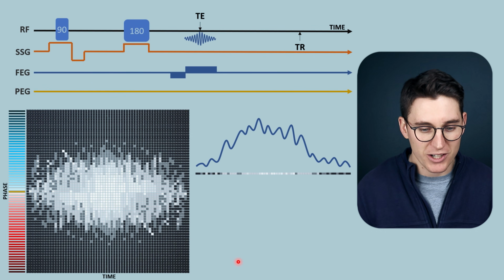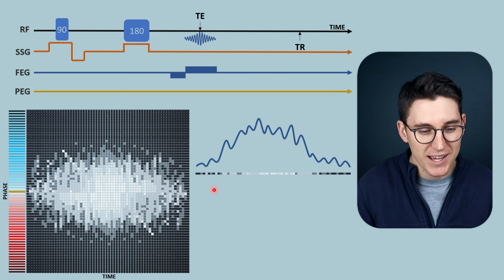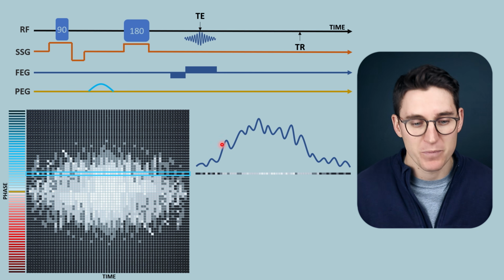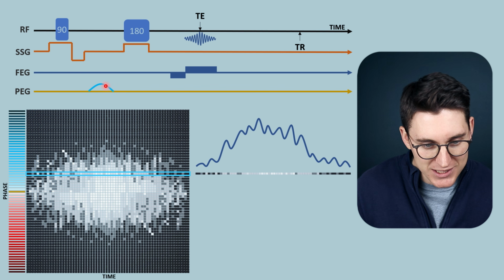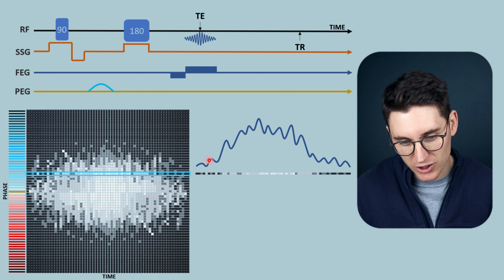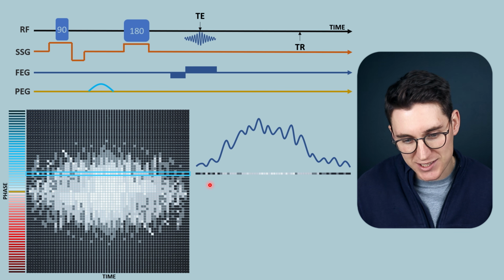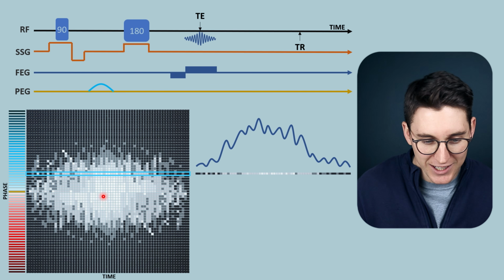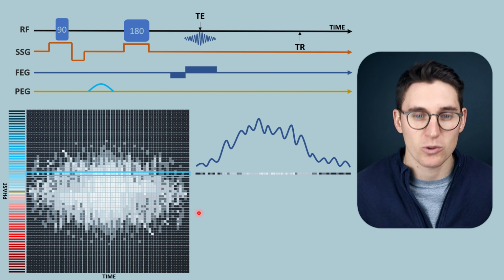Now let's look at how we generate a different row within K-space that has some phase encoding data baked within the signal here. You can see we've applied a specific magnitude of phase encoding gradients along the y-axis. And you can see that our signal has decreased slightly. The data points we're getting out represent slightly lower values than our non-phase encoded line that we've just acquired.